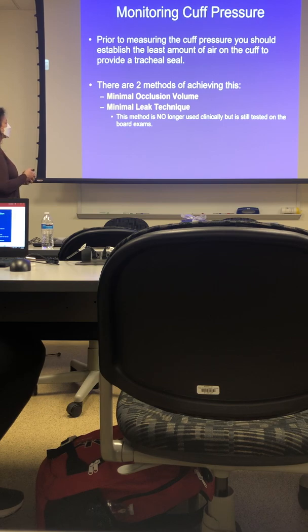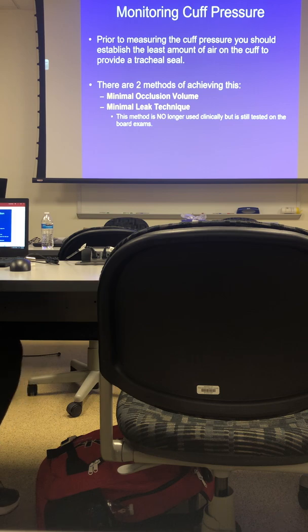So minimal occlusion volume is done like this. I would have my stethoscope out, and I'm gonna listen.